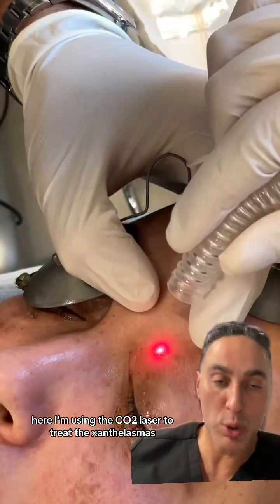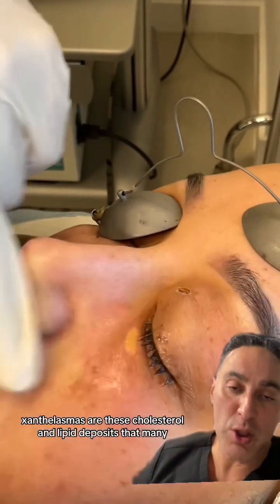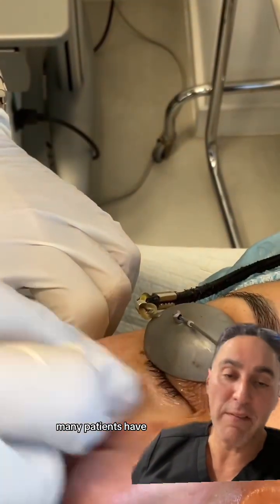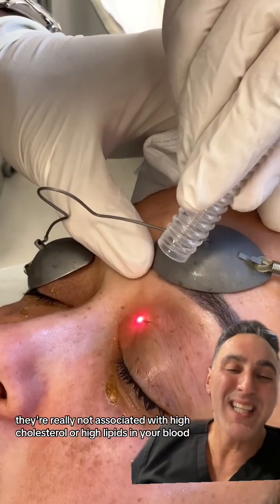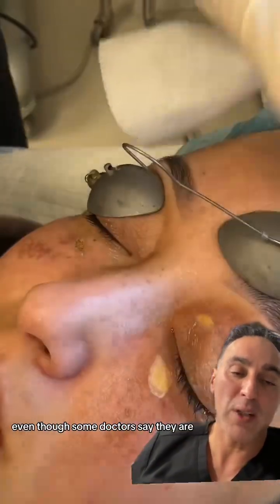Here, I'm using the CO2 laser to treat the xanthalasmas. Xanthalasmas are these cholesterol and lipid deposits that many, many patients have. It's unsightly — it's really a cosmetic concern for the most part. They're really not associated with high cholesterol or high lipids in your blood, even though some doctors say they are.